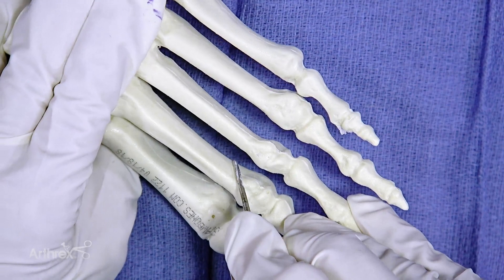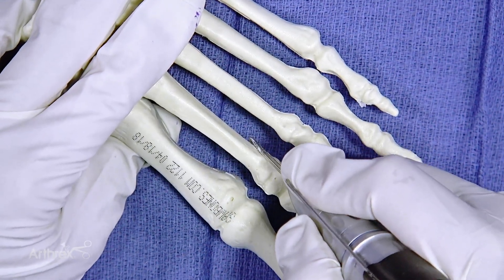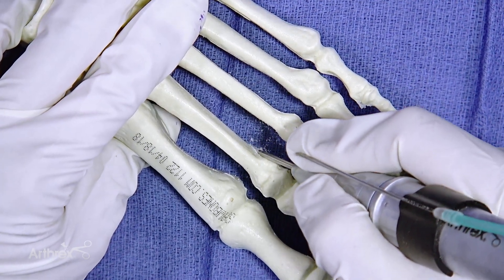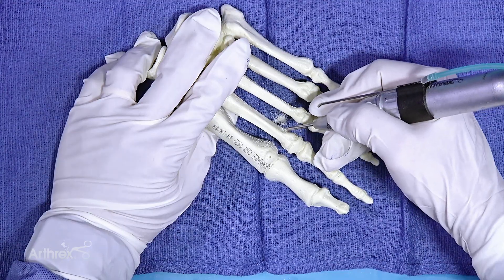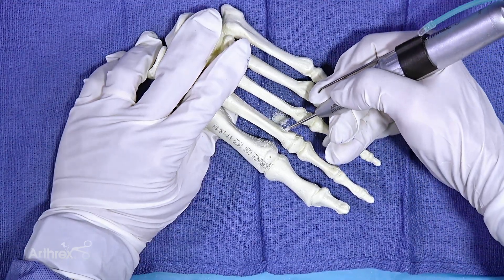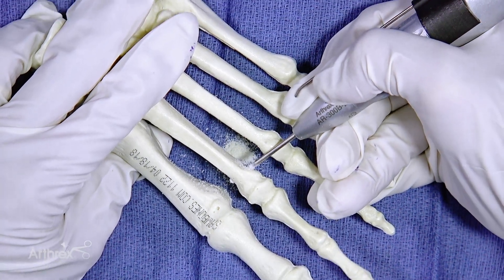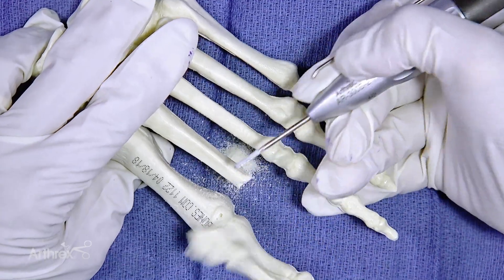You're going to go to the plantar cortex to make sure you get it, and then you'll start your burr. As you come up, you'll swing your hand slightly proximal so you can create a 45 degree oblique.